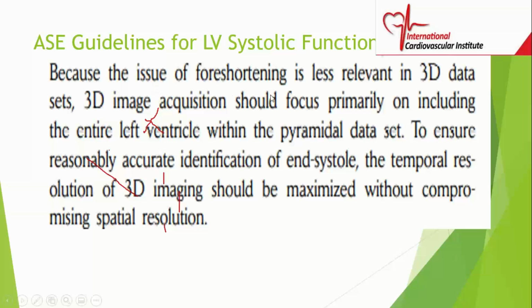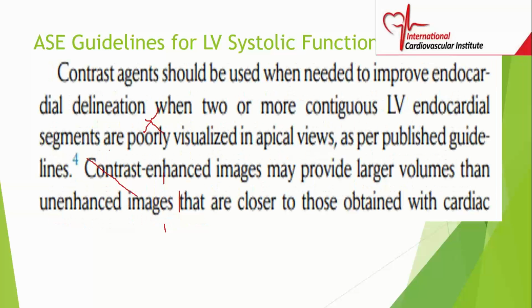Because the issue of foreshortening is less relevant when you do three-dimensional echo. If you have the ability to do it and you're comfortable in doing three-dimensional echo, then that's what you should use. But if you're not trained to do it, don't just do it for doing it's sake, because you have to know what you're doing.